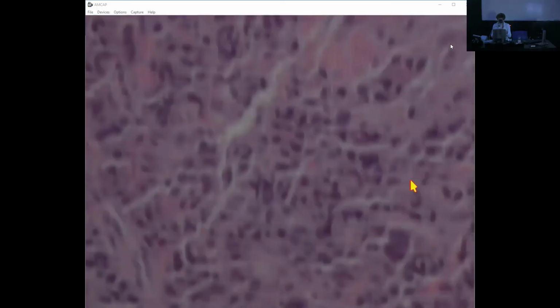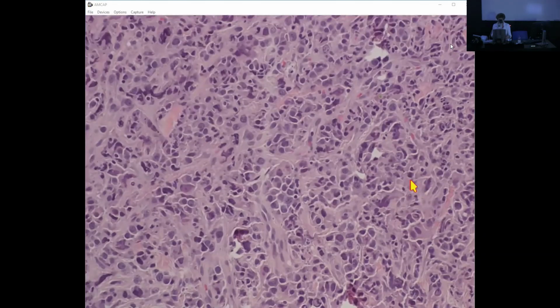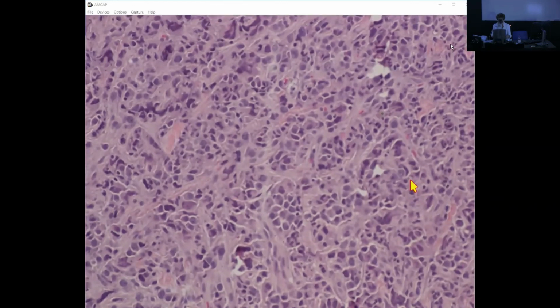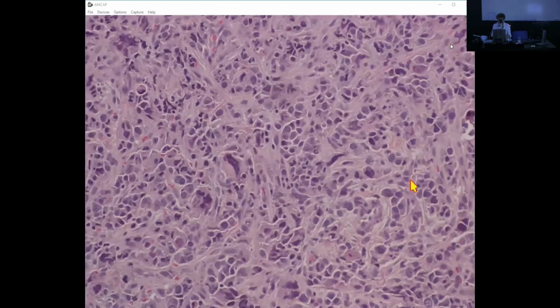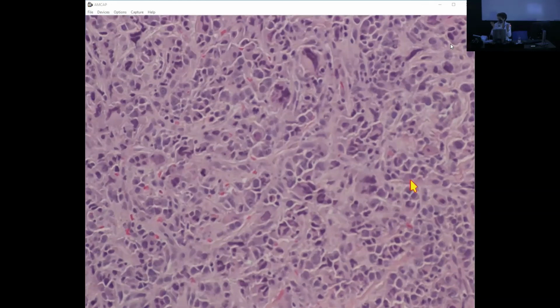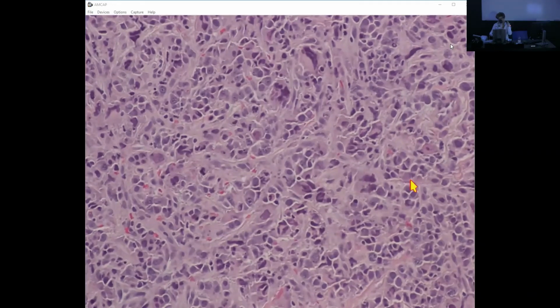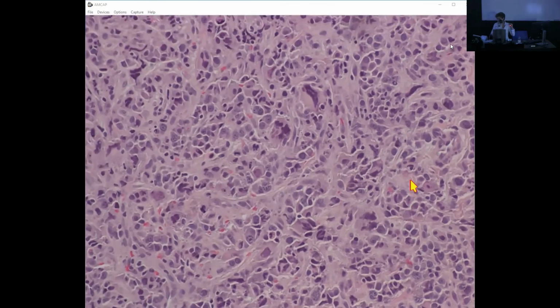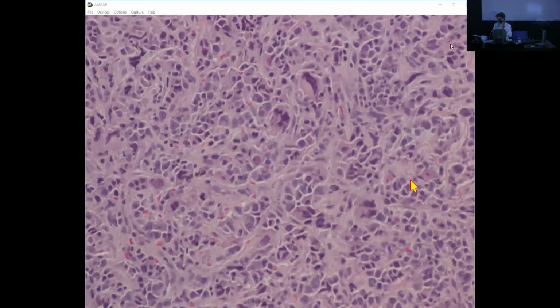So this is a case of a plasmacytic neoplasm that, because it's single cells, and it was in the breast and it was triple negative, was thought to be an invasive pleomorphic high-grade lobular carcinoma. And thankfully we caught it thanks to the biopsy of the paraspinal lesion that was probably the primary, and this was the metastasis, not a reverse.